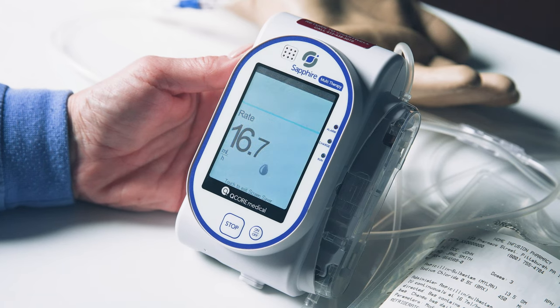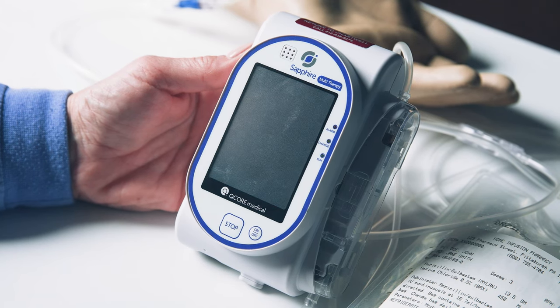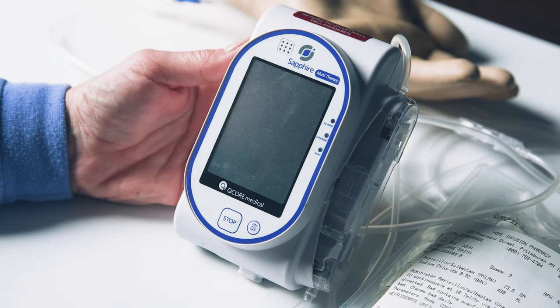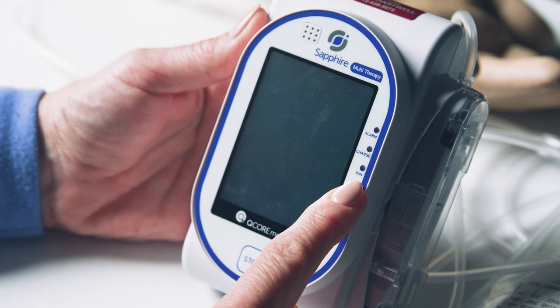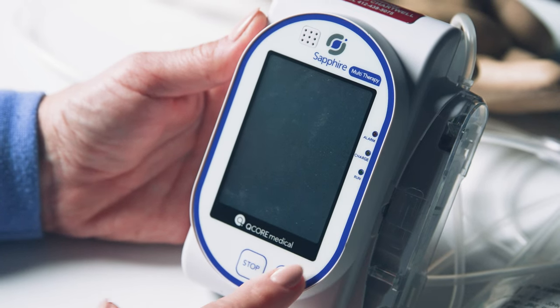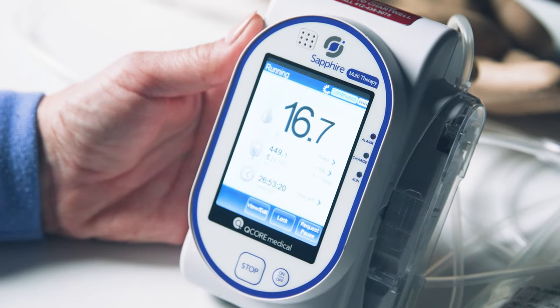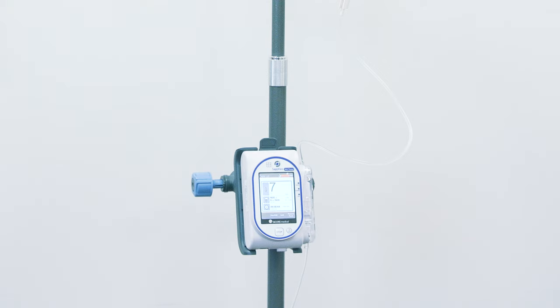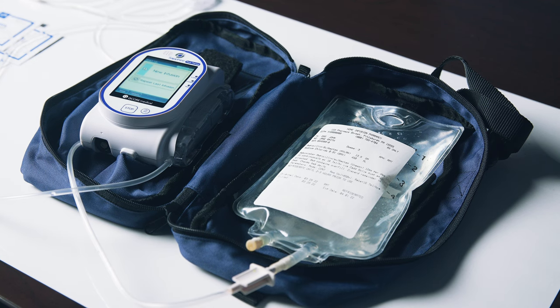The display screen may enter a screen saver mode with a dimmer screen showing the rate, or the screen may turn off while running. If this occurs, the green light on the sidebar will blink to indicate that the pump is still running. You can press the on/off button if the screen has gone dark. If your medication is not attached to an IV pole and you have a pouch or a backpack, you can now place your medication bag and pump inside the bag during your infusion.